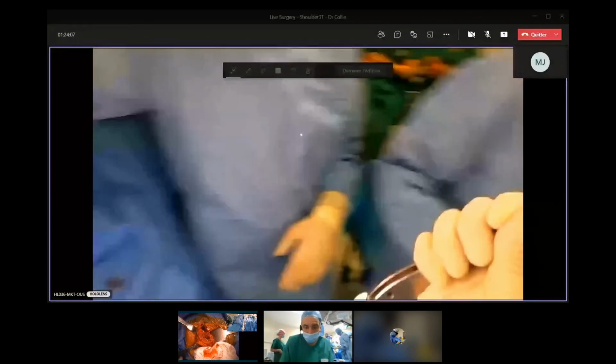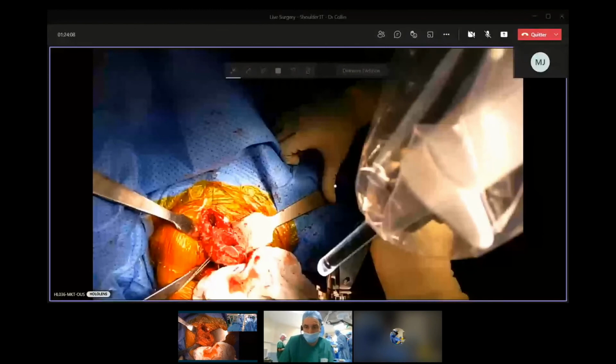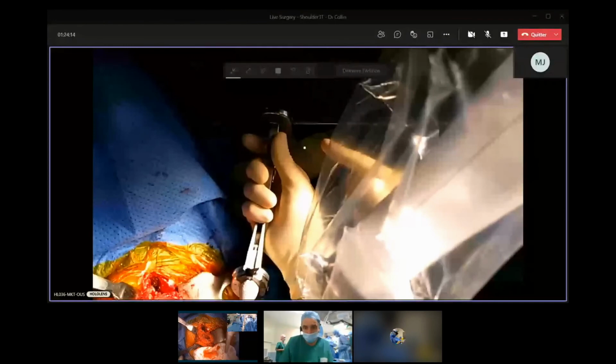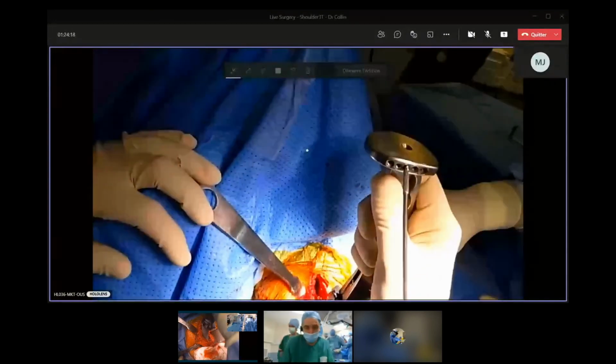It's surgery. Okay. This is okay. We check. C'est une tige en 2B, c'est un plateau en 0, petite excentration, et la tige de rétroversion, elle est sur 20 degrés. Merci, Alex. So here, I have my landmark.